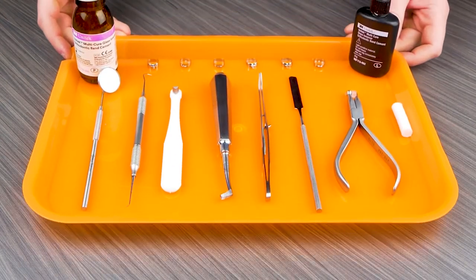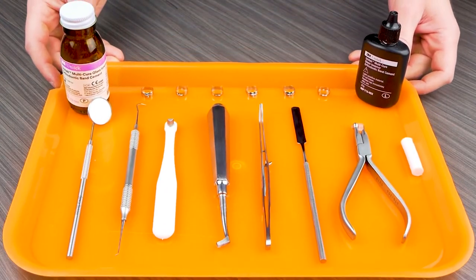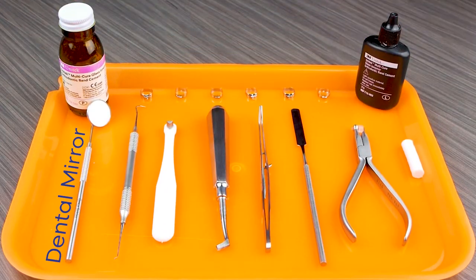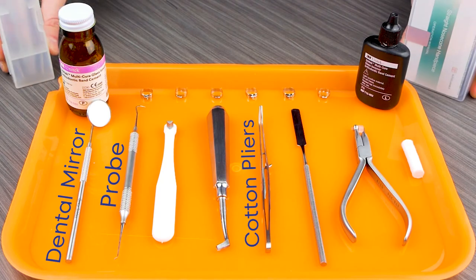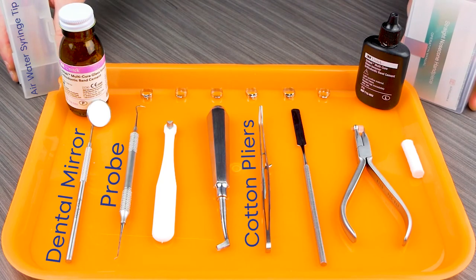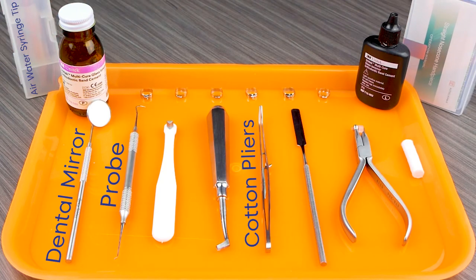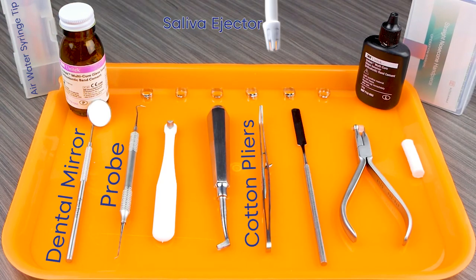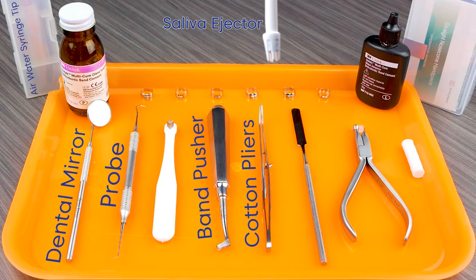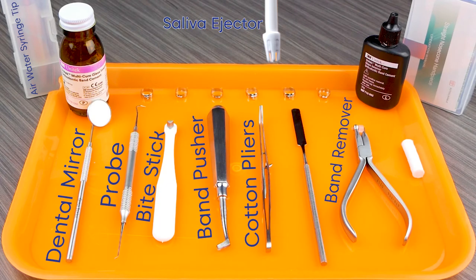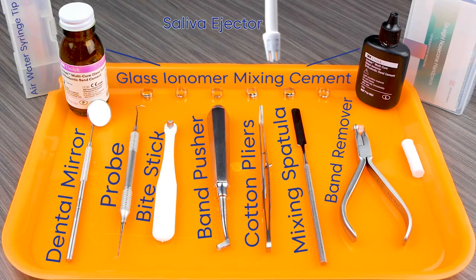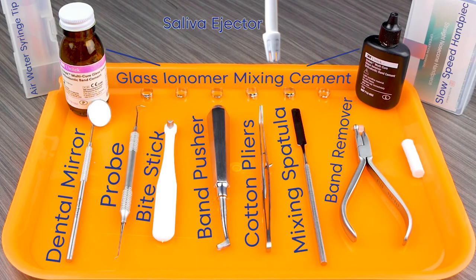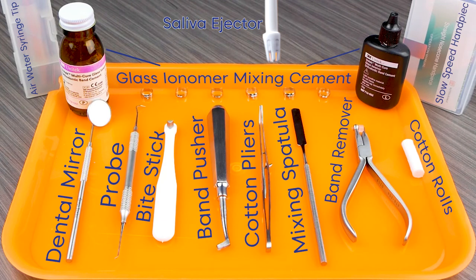The instruments used in this procedure are dental mirror, probe, cotton pliers, air water syringe tip, saliva ejector, band pusher, bite stick, band remover, mixing spatula, glass ionomer mixing cement, slow speed handpiece, and cotton rolls.